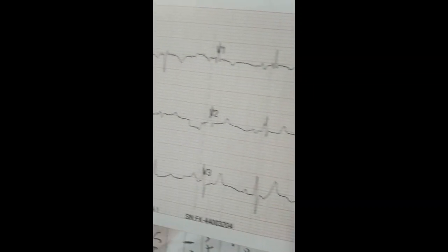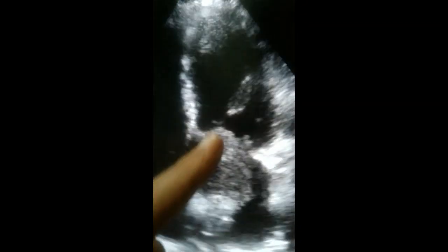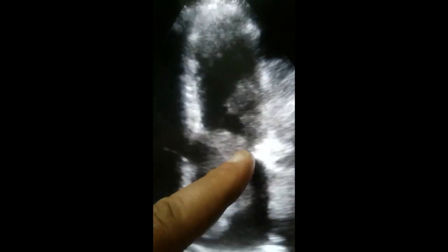When we were doing the echocardiography, we discovered this — the third case of benign cardiac tumor, which is called myxoma, characteristically moving in systole and diastole through the mitral valve. It is connected to the inter-atrial septum, which is characteristic of atrial myxoma.